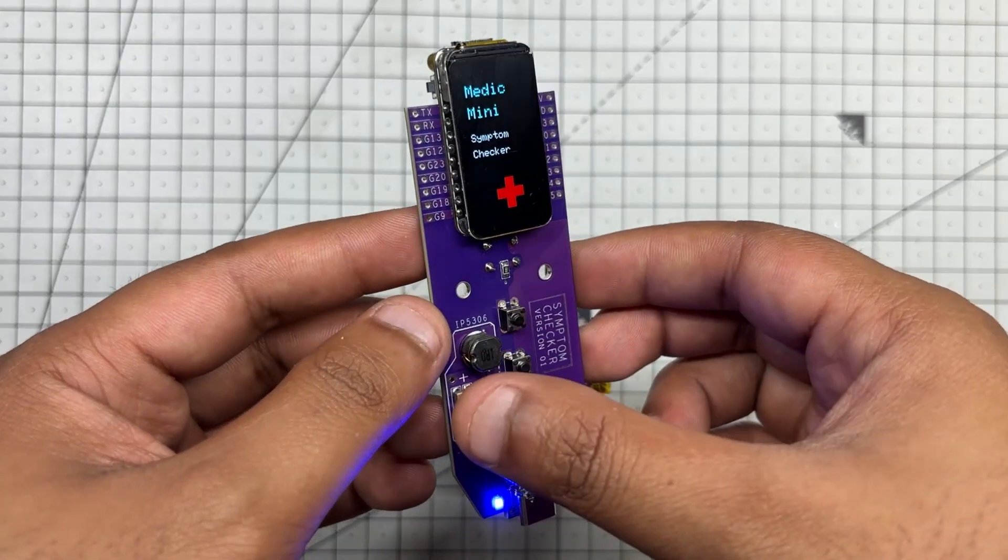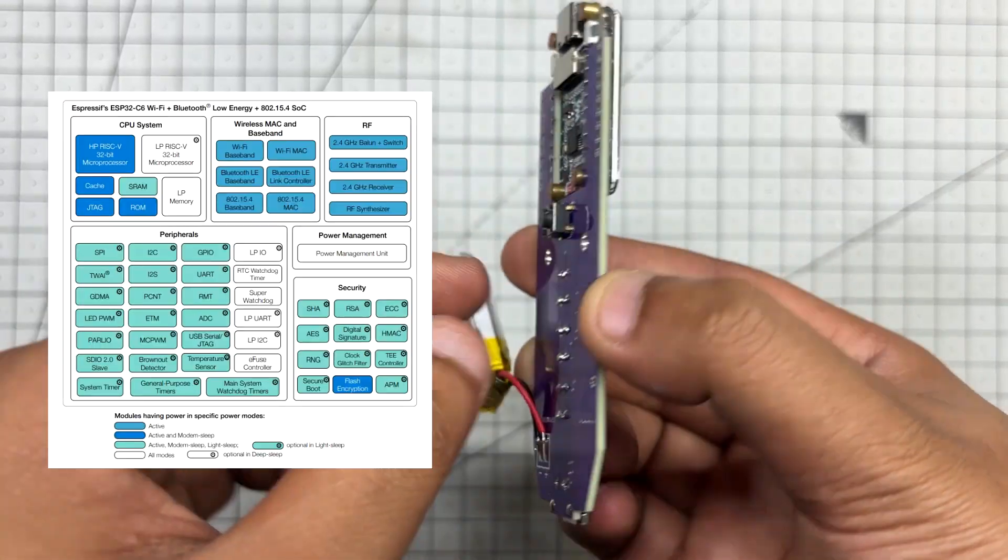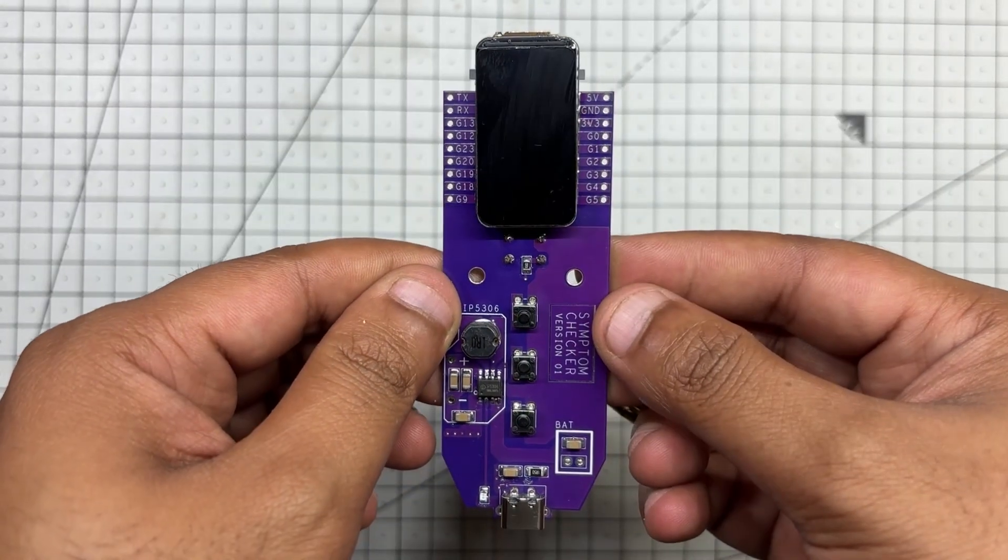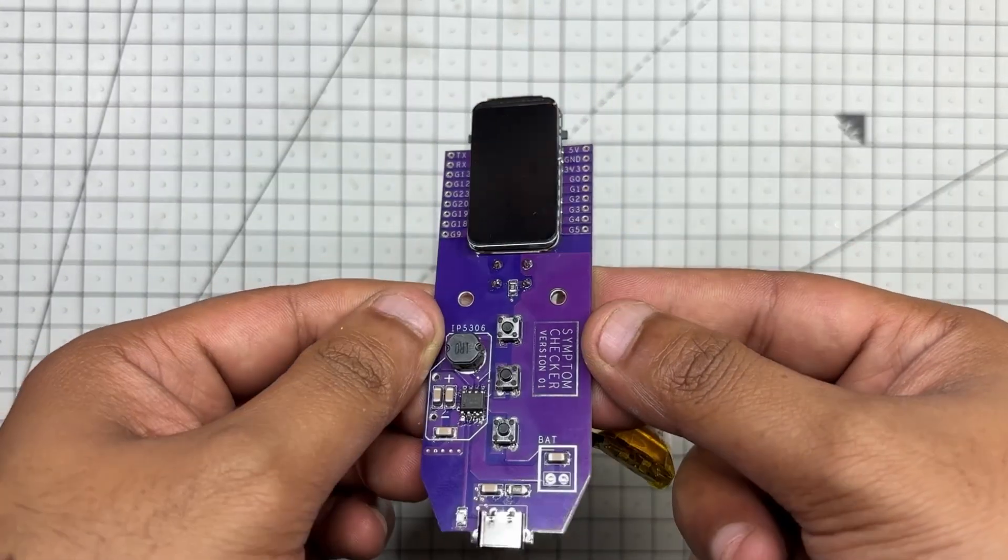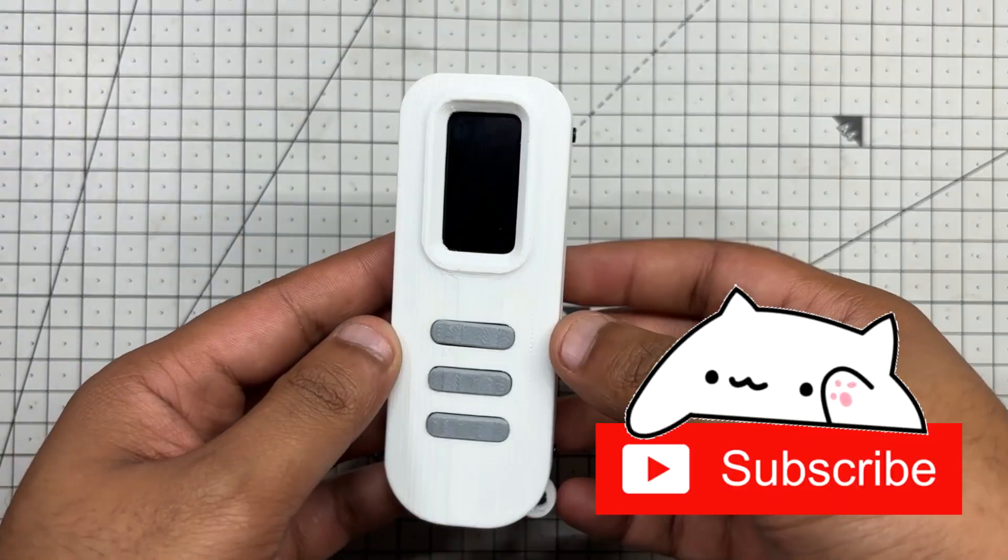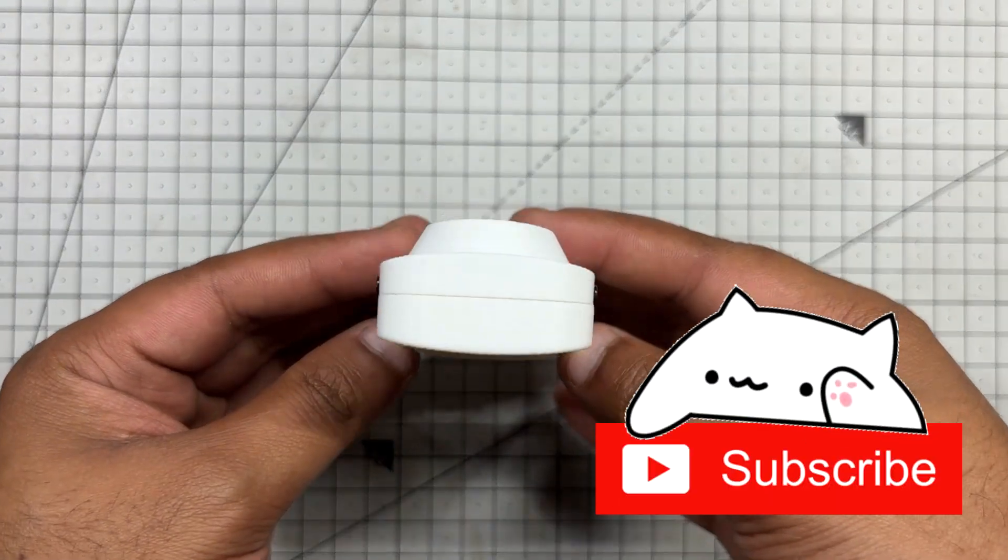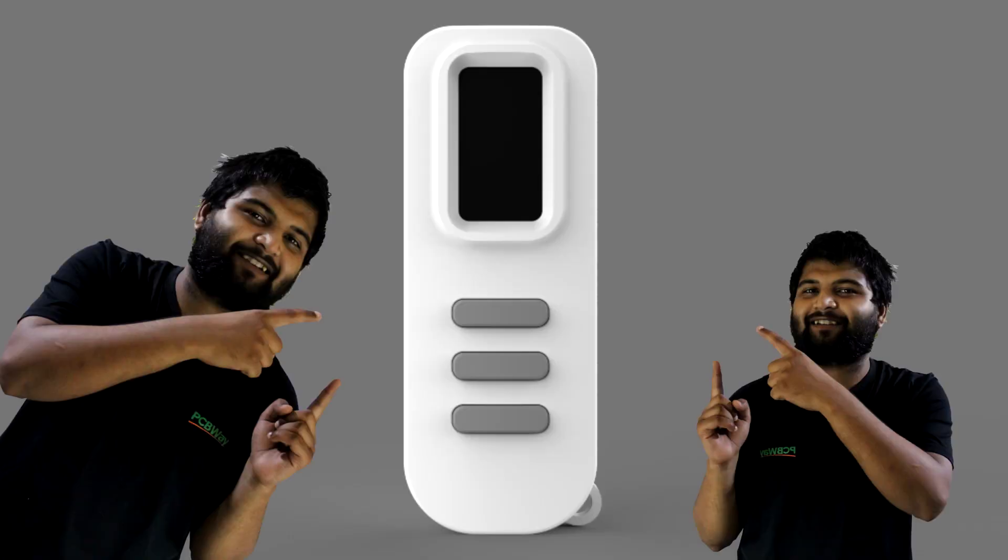At its core, Medic Mini runs on ESP32-C6, paired with the 1.47 inch WaveShare display. Housed in a custom PCB and a 3D printed enclosure designed from scratch.